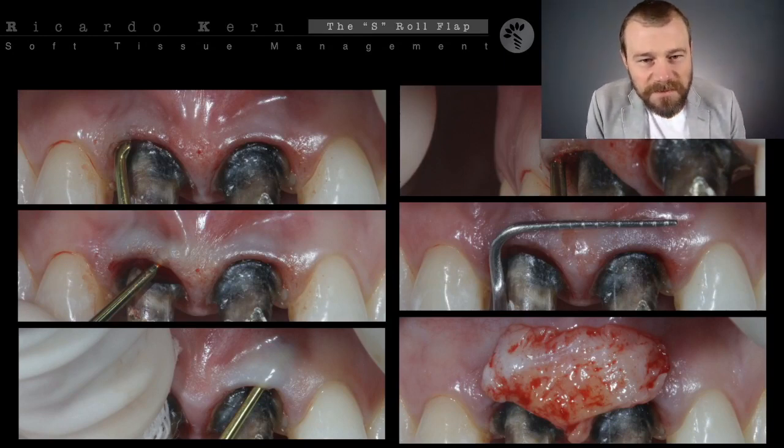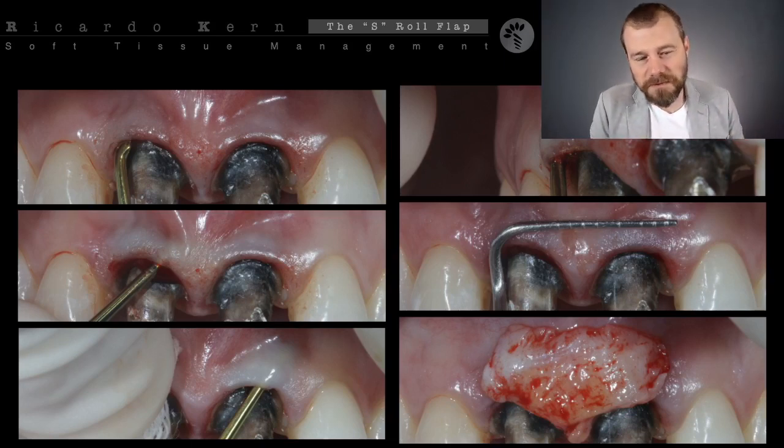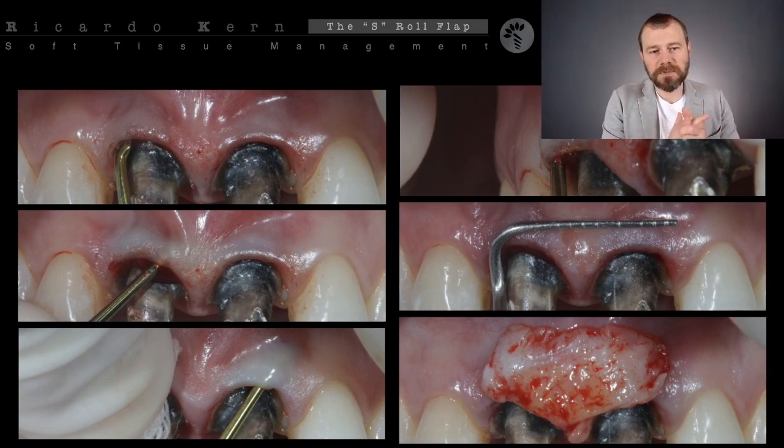Look at this root, look at the color of this root. It's completely dark, okay? So really the change in the color is huge. Probably this difference in the color is due to the metals used on this core. We have some combination of alloys on these cores that really cause the change in the color of this root.